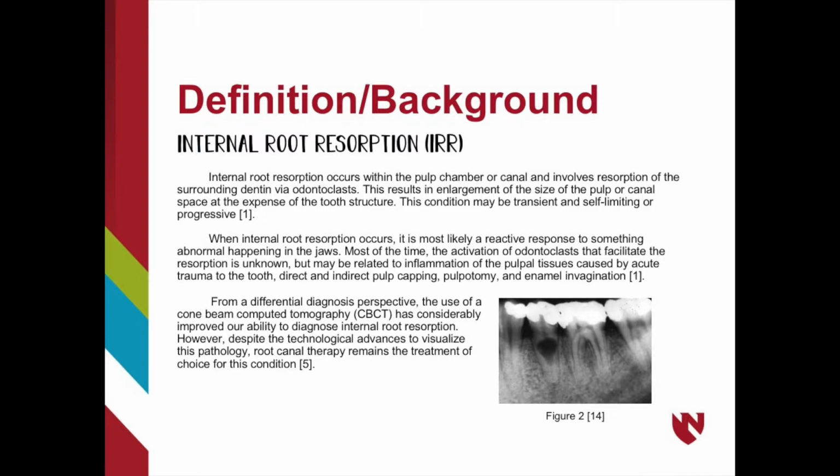Most of the time, the activation of odontoclasts that facilitate the resorption is unknown, but may be related to inflammation of the pulpal tissues caused by acute trauma to the tooth, direct and indirect pulp capping, pulpotomy, and enamel invagination. From a differential diagnosis perspective, the use of a cone beam computed tomography has considerably improved our ability to diagnose internal root resorption. However, despite the technological advances to visualize this pathology, root canal therapy remains the treatment of choice for this condition. In Figure 2, a radiolucency is observed in the canal space of the premolar, which indicates the presence of internal root resorption.